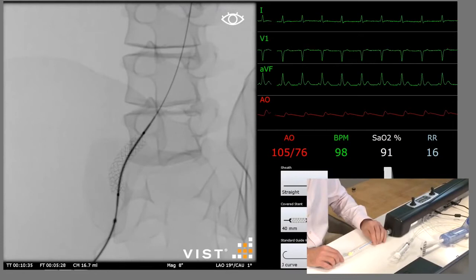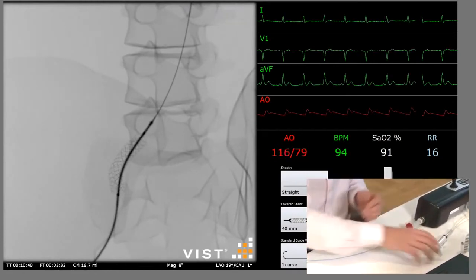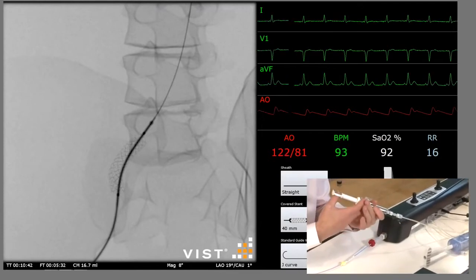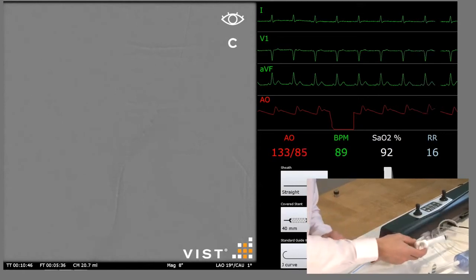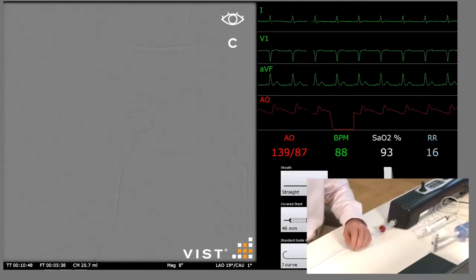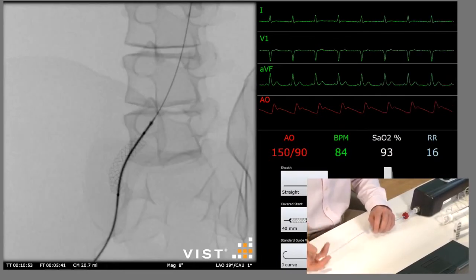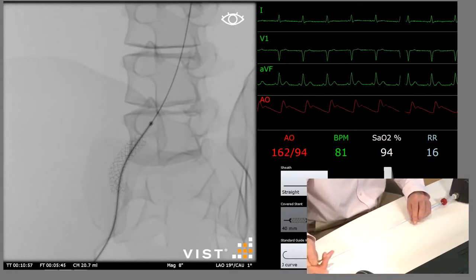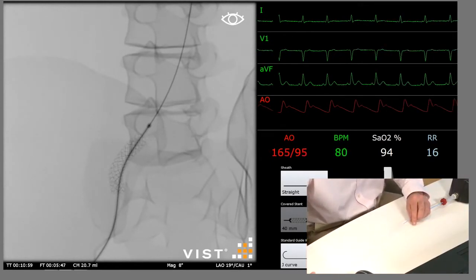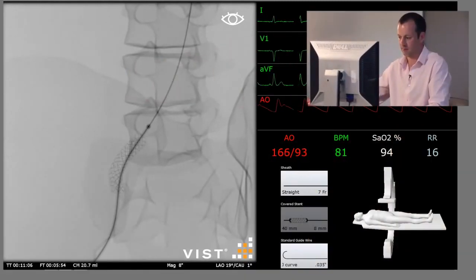At this stage, best thing to do, if you can inject via the sheath, is just advance it up past the balloon again. Repeat your angiogram from above. That confirms we've achieved hemostasis. There's no longer any bleeding from the vessel, and that we can remove the balloon. And as a final act, it is sensible to do a flush aortic angiogram, just to double check.